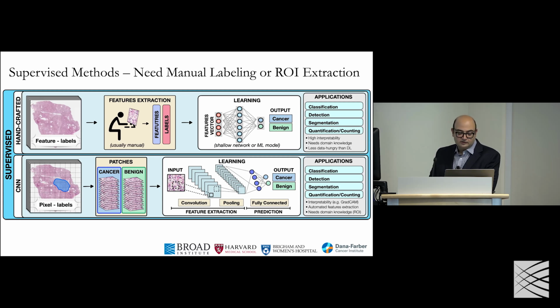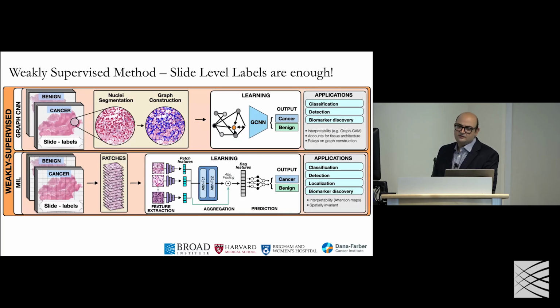But the issue is the labels. We don't have pixel level annotations as part of the regular clinical workflow. And that's where all these weakly supervised methods that have been developed for this kind of data come in.